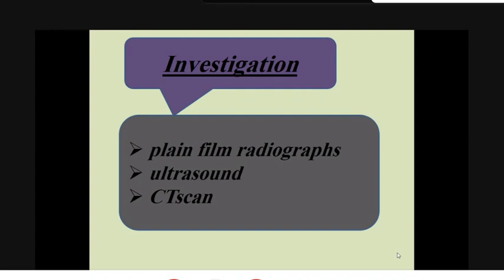The third reason for using chest X-ray is that acute abdominal conditions may be complicated by chest pathology. For example, pleural effusion frequently complicates acute pancreatitis.